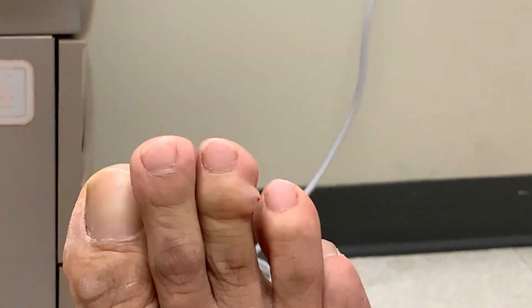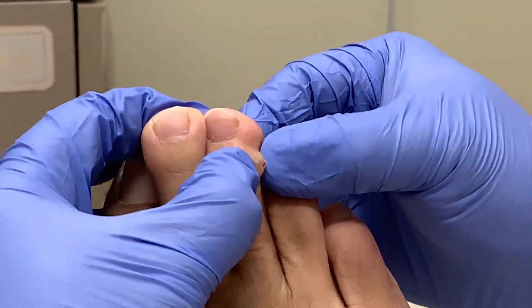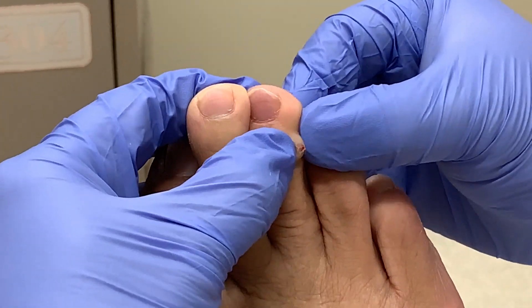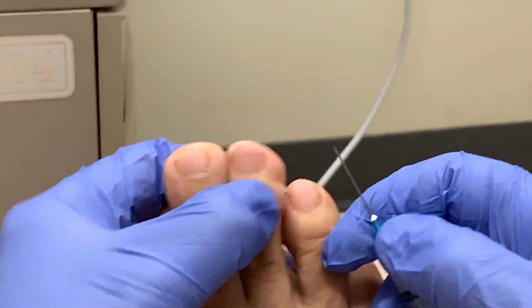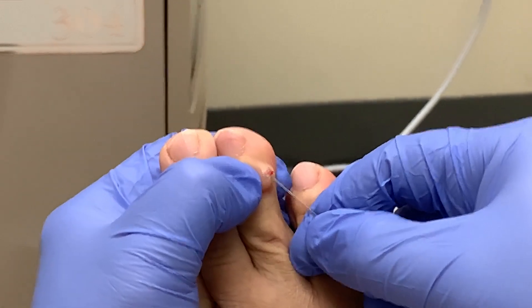Then they proceed to squeeze out the fluid, then use the needle to puncture it again to make the hole just a little bit bigger.